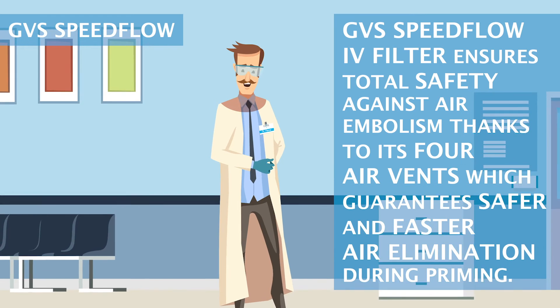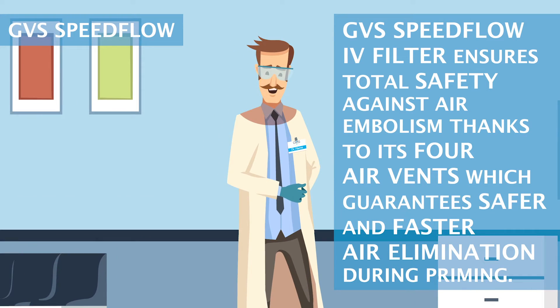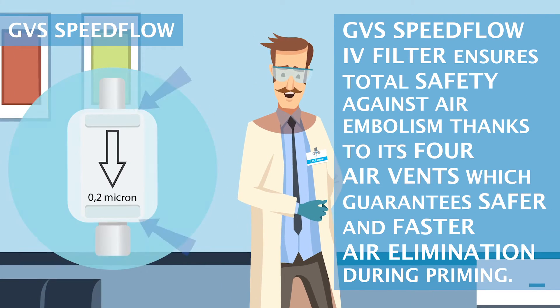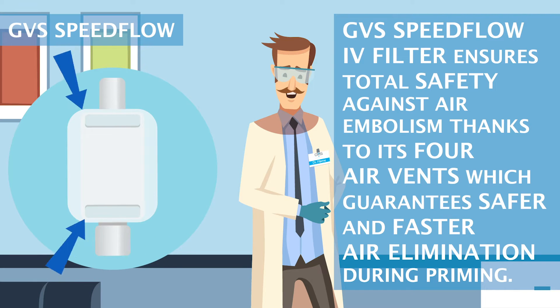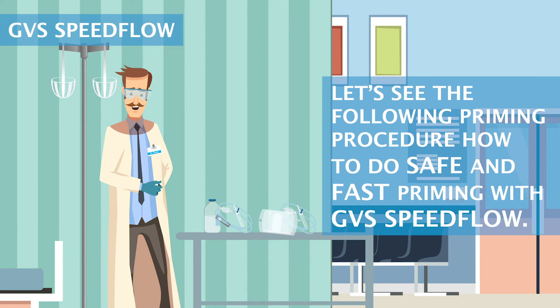GVS Speedflow IV Filter ensures total safety against air embolism thanks to its four air vents, which guarantees safer and faster air elimination during priming. Let's see the following priming procedure: how to do safe and fast priming with GVS Speedflow.